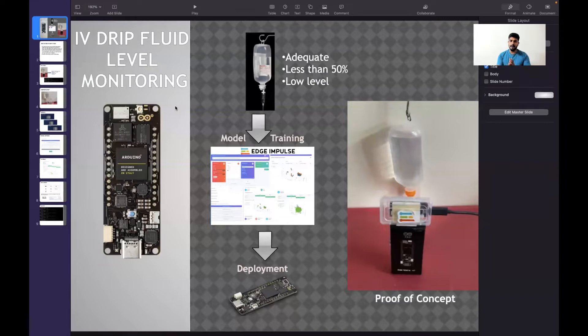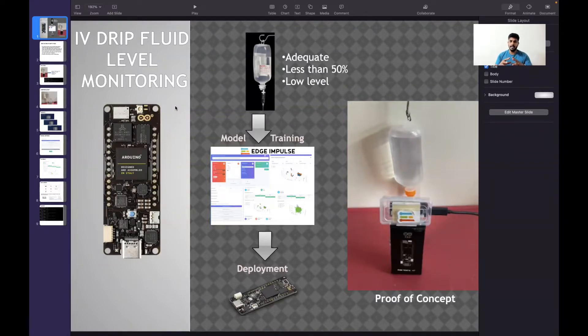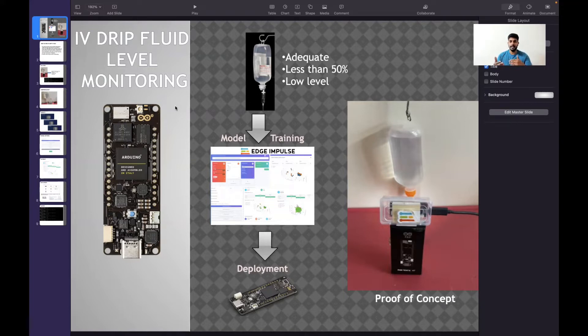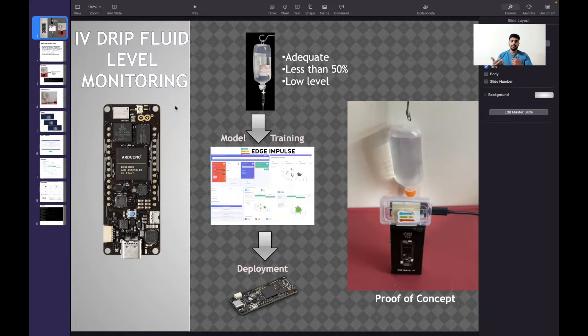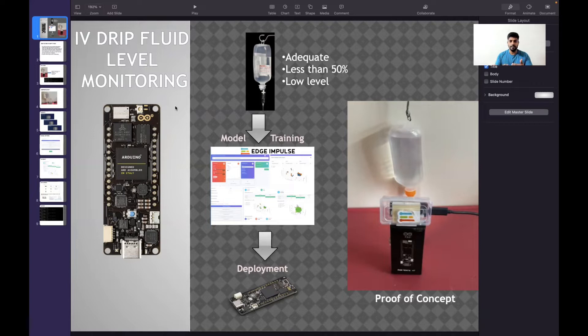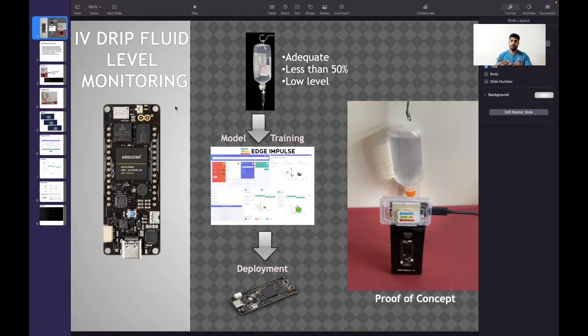In this prototype, I used an Arduino Portenta H7. I collected a dataset with three types: adequate, less than 50%, and low level. I trained the model using Edge Impulse software and deployed it back to the Arduino Portenta.